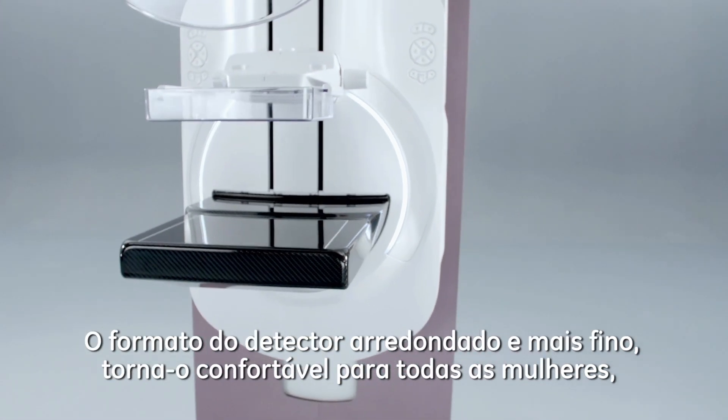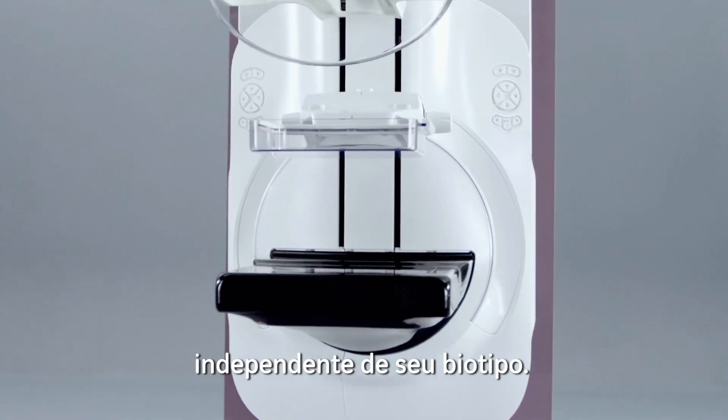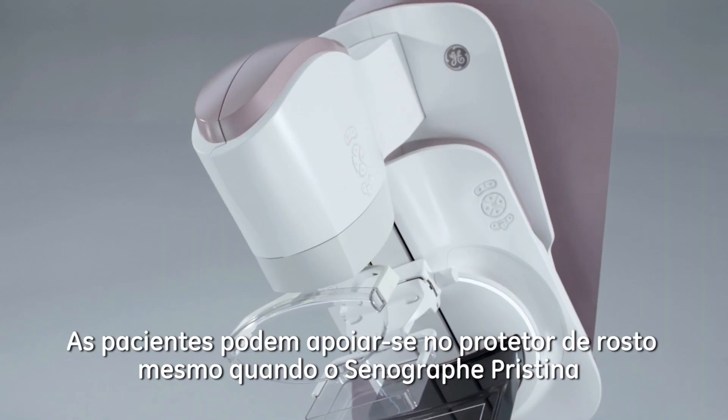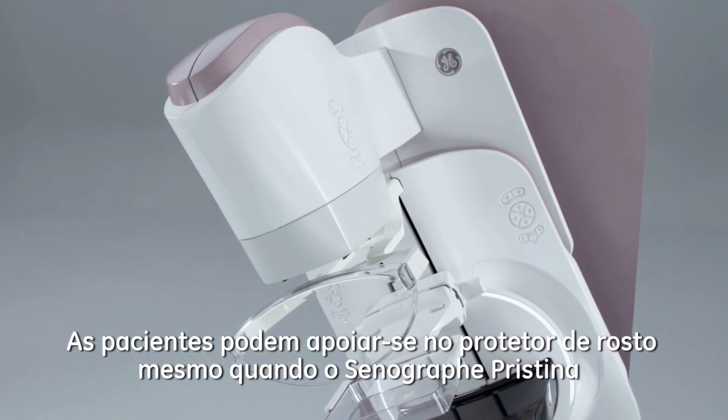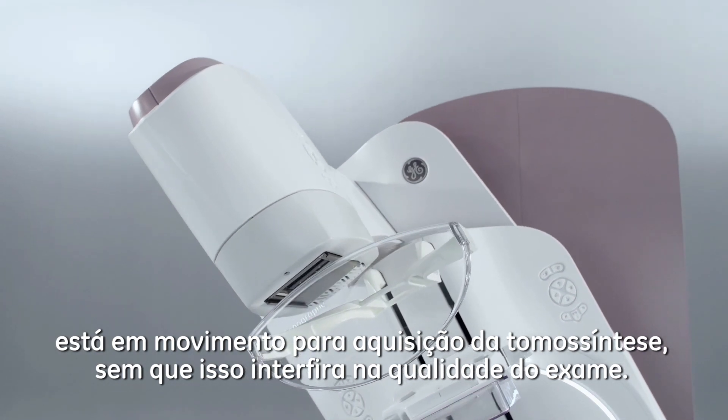The design of the breast support featuring rounded corners and a very thin breast support make it comfortable for any woman. Patients can lean on the universal face shield even when Senographe Pristina is moving for a tomosynthesis acquisition.